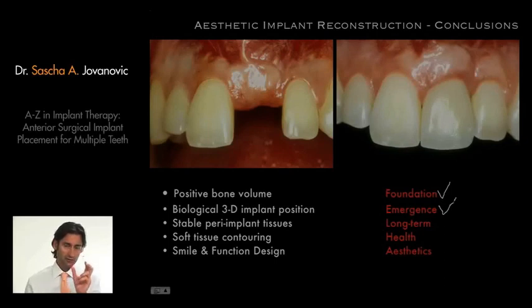And the solution we have here is to introduce pontics. So that's a very nice solution, which of course is not possible for 2 implants or for 2 teeth, but for more than 2 teeth it's possible. The third problem we have here, more than with single teeth, is the soft tissue. If you introduce pontics, you need more soft tissue.